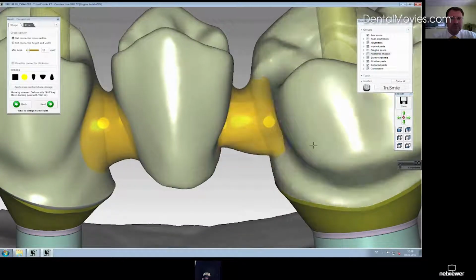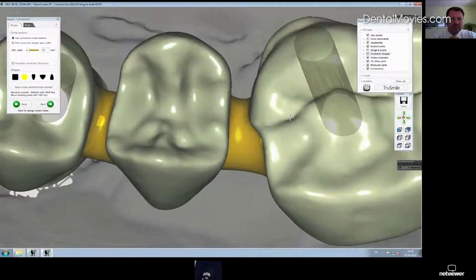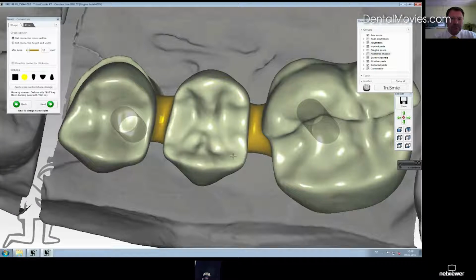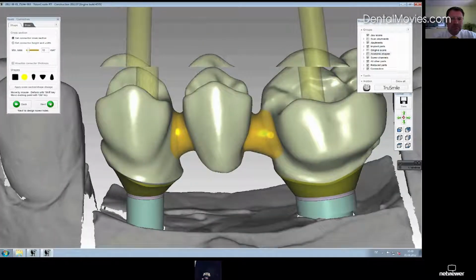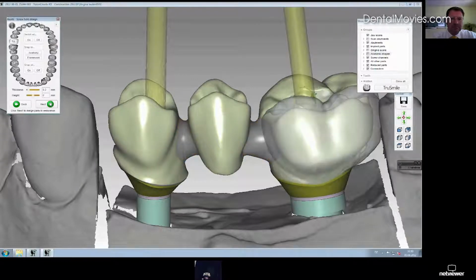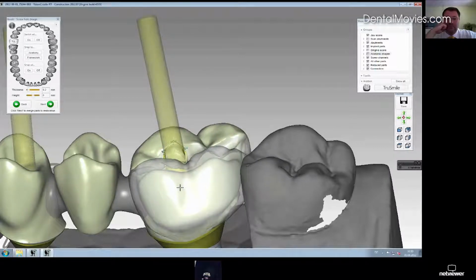And you can change the complete position of the connector, or select different points and set the connector onto the middle of the point, or set it back between the teeth, or take the complete connector and set it here in the middle of the construction.